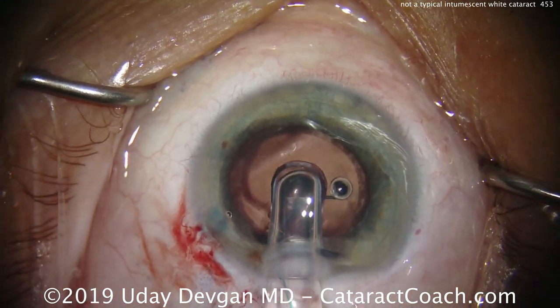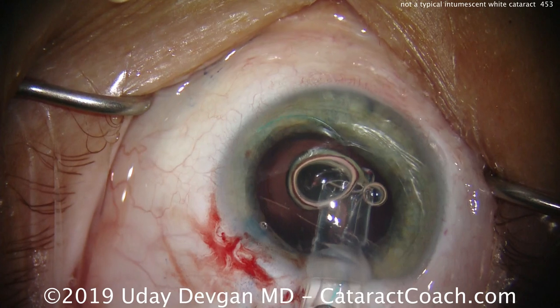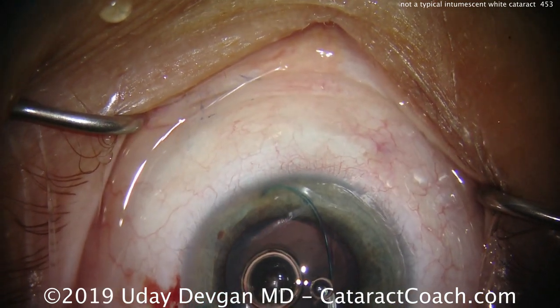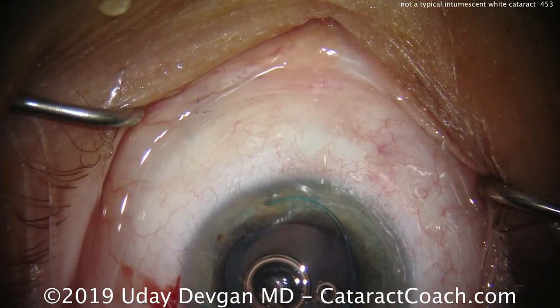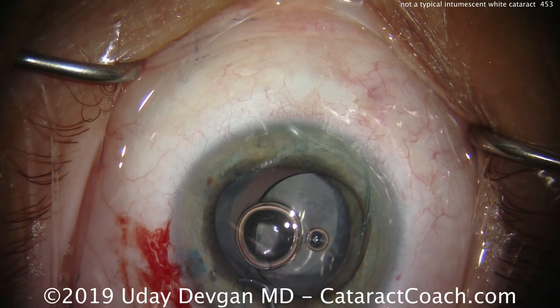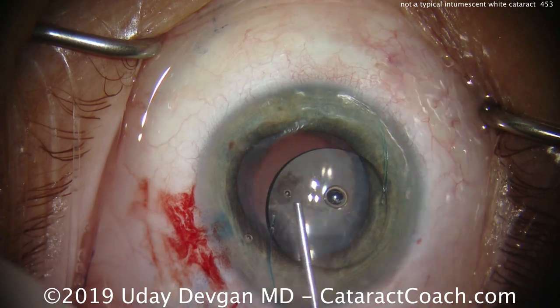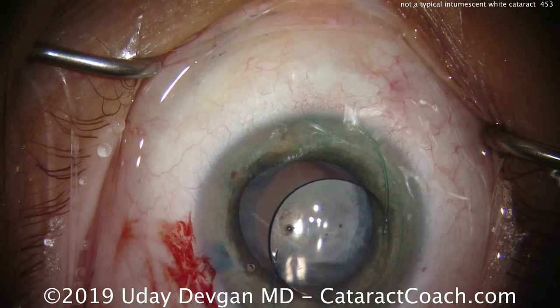Here comes our IOL — it's been loaded into the injector. You can see how soft the globe is because it's unicameral with no infusion line yet. We'll deliver this three-piece IOL on top of the iris initially. Keeping in mind orientation: the first haptic should come out like the number seven. That looks great. Slowly unfold — make sure the IOL optic goes in straight. The overall haptic should look like an anti-S, not like the letter S.